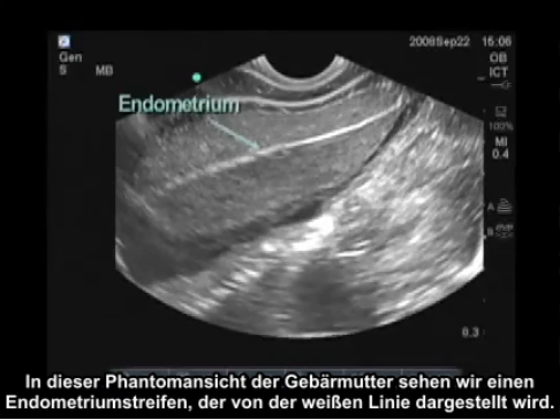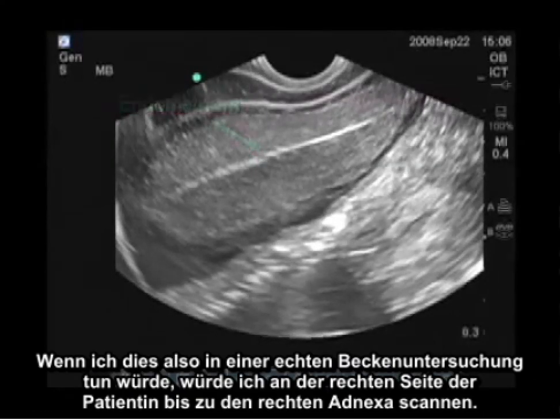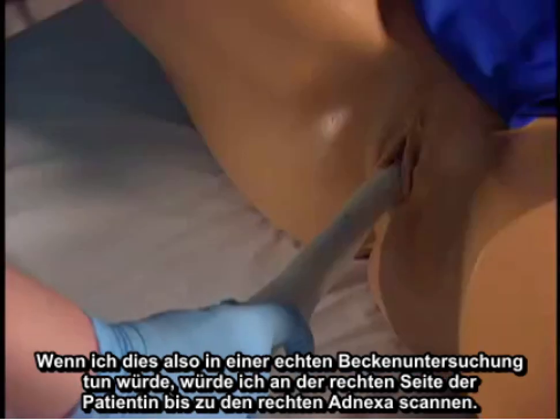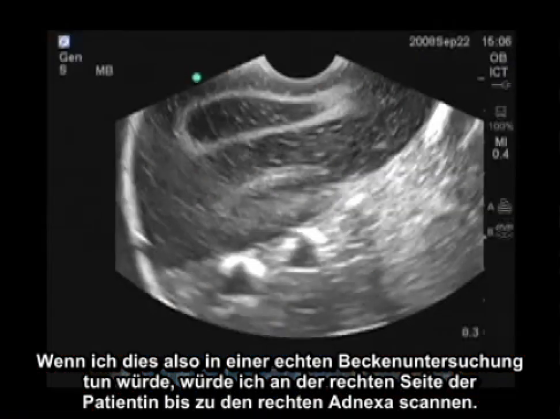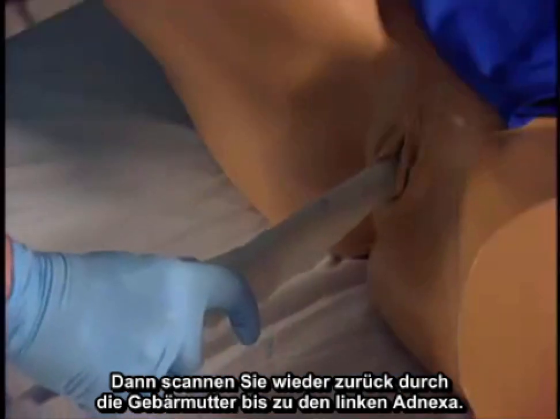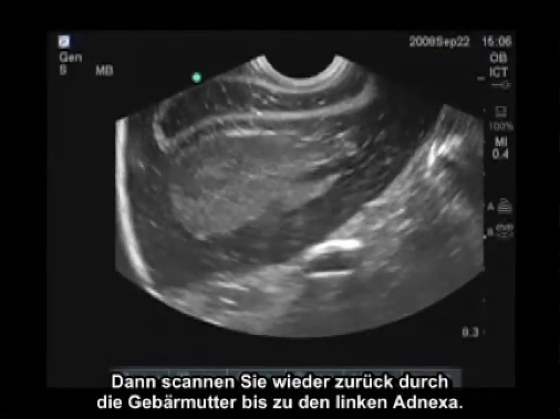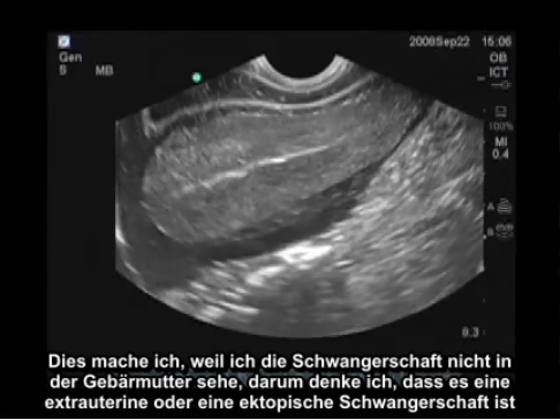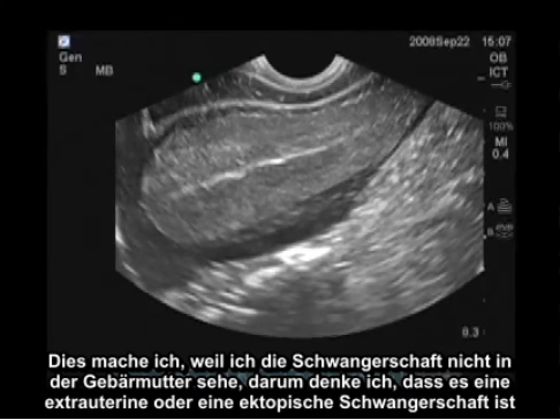If I was doing this as a real pelvic exam, I would scan to the right of the patient all the way through to the right adnexa, and then back over all the way through the uterus to the left adnexa. I'm doing this because I don't see the pregnancy inside the uterus, so I'm suspecting that it's extrauterine or an ectopic pregnancy.